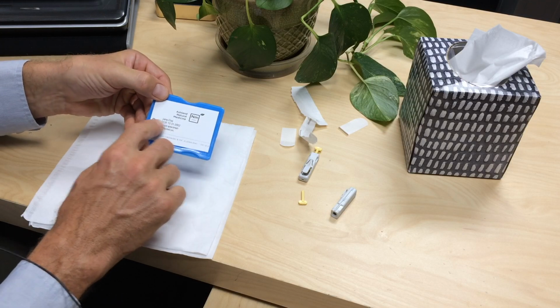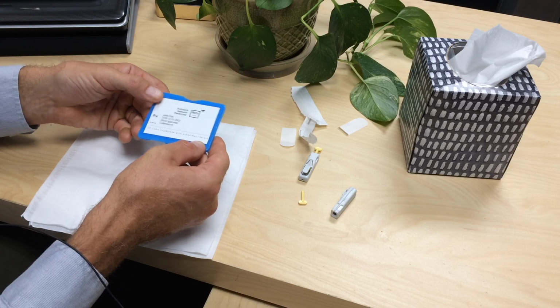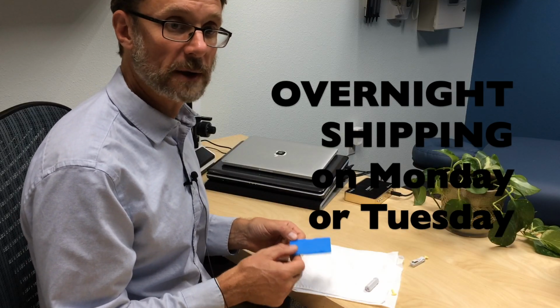This will arrive with your name and date of birth on it. Pack this back up in the bubble wrap, and this can only be shipped to our office overnight on a Monday or a Tuesday.